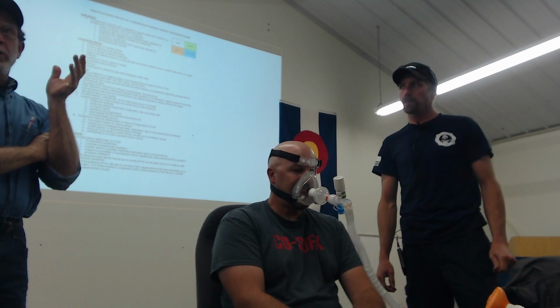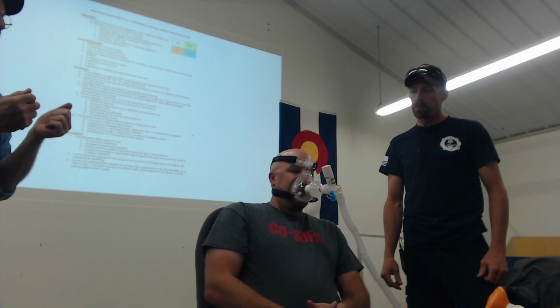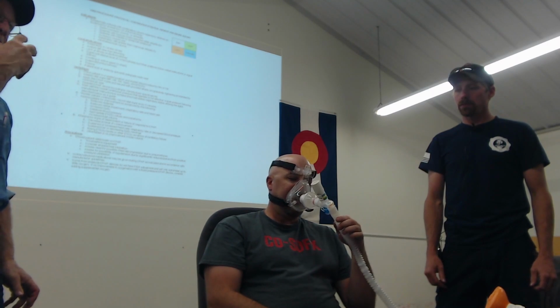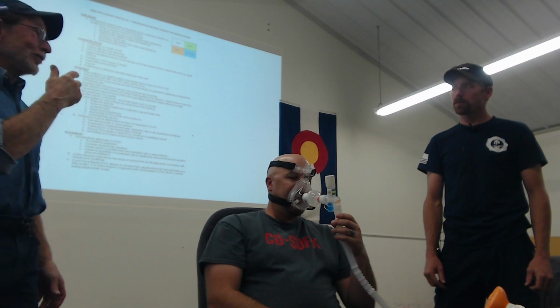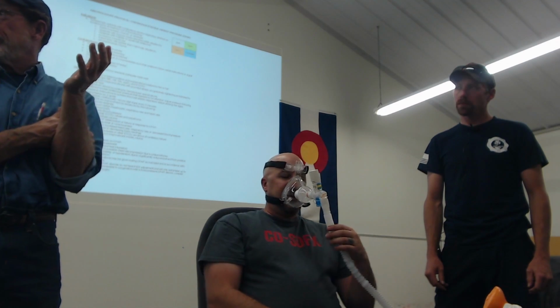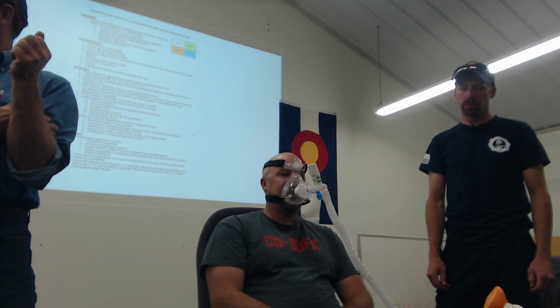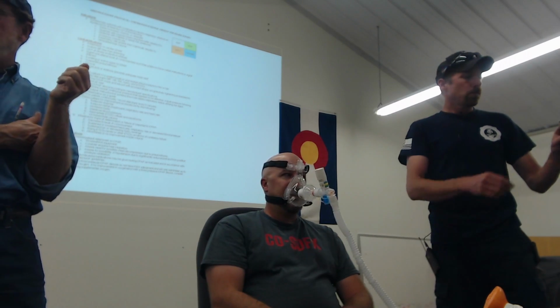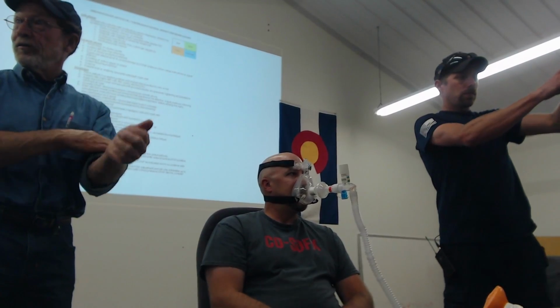So Tyler made a real important point. A lot of this, as you can see, is working with the patient to get them used to it. You can take it off, put it back on, take it off. You might even have to go back to the non-rebreather. But it's a therapeutic intervention. It's not just to make them feel better. Ideally, it's great if they feel better because that means they're getting better. But this is a therapeutic intervention that actually is making them better. And that's part of the coaching.